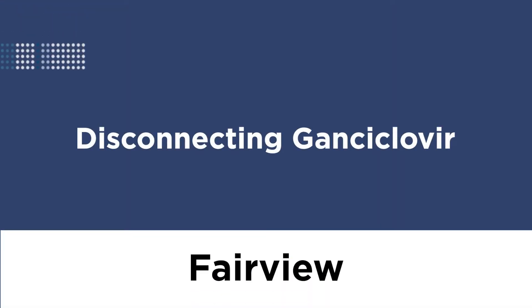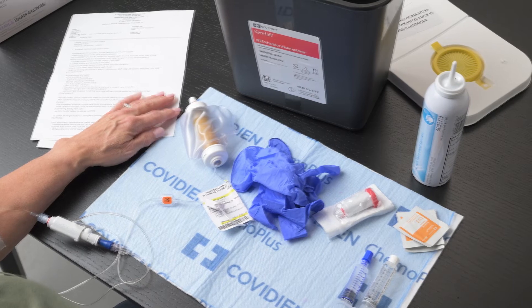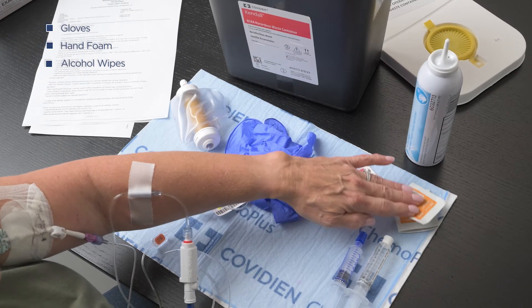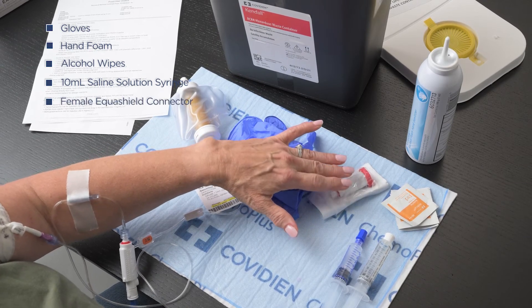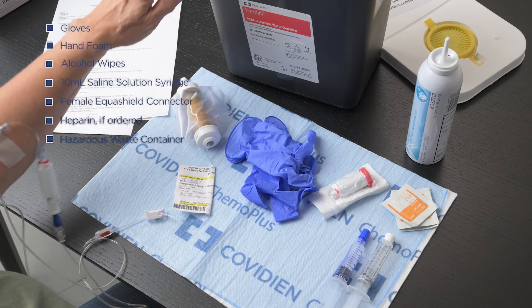Disconnecting Ganciclovir. When your infusion is complete, you will follow similar steps to prepare for disconnection. Begin by gathering your supplies. For this process, you will need gloves, hand foam, alcohol wipes, a 10-milliliter saline solution syringe, female Equishield connector, heparin if ordered, and a hazardous waste container.